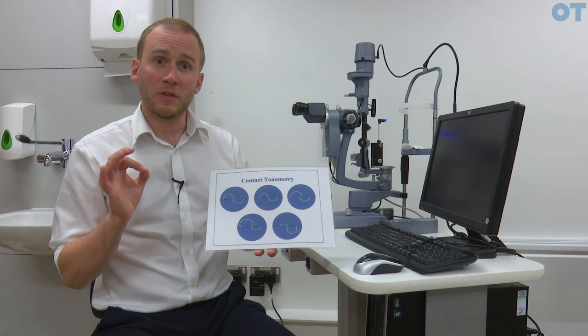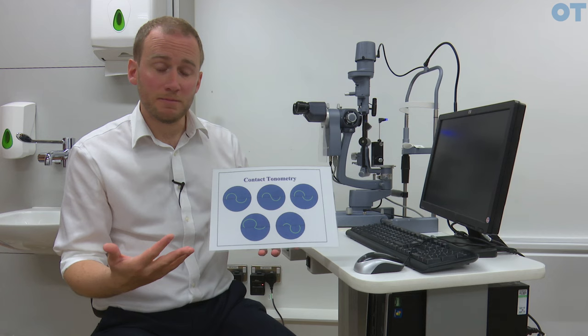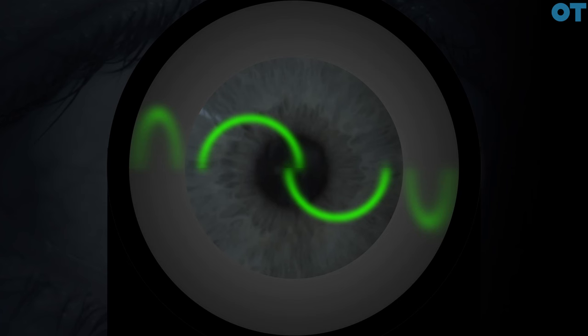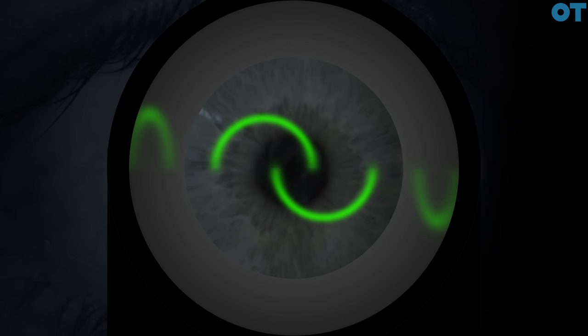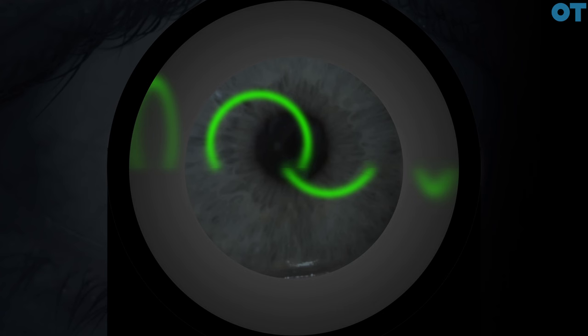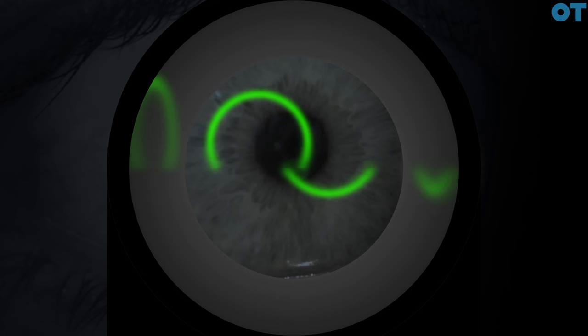When we have our endpoint we need to make sure we are getting an accurate measurement. The optimum endpoint for both the Perkins and Goldman techniques is where the inner aspect of the two mires — the superior and the inferior mire — is just touching, not overlapping but touching. If we haven't applied enough pressure or weight to the cornea we need to increase the weight on the dial. If the mires are crossing over we need to decrease the amount of weight. There are also vertical misalignment errors where the probe is either too low or too high.